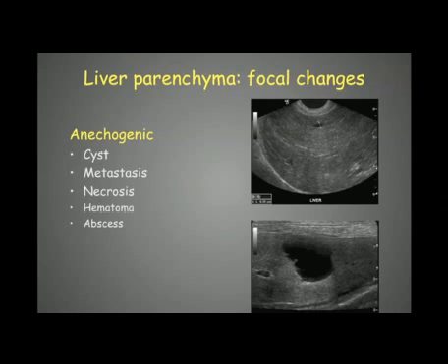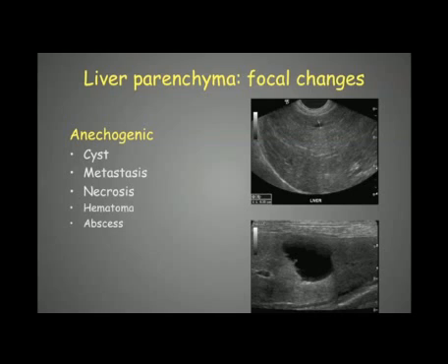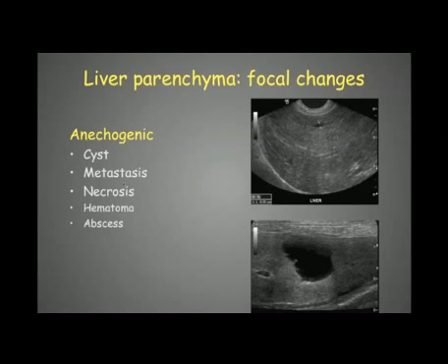The liver parenchyma can also present focal changes. Focal anechoic lesions are mostly small or large cysts — very hypo- to anechoic structures that create distal acoustic enhancement, appearing brighter underneath the cyst due to decreased attenuation of the ultrasound beam by fluid. However, metastases, necrotic areas, hematomas, or abscesses can also appear anechoic.